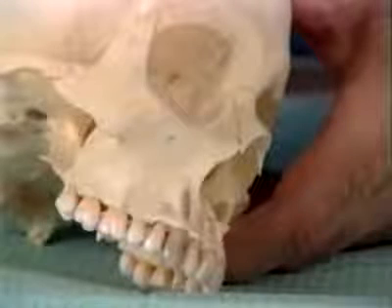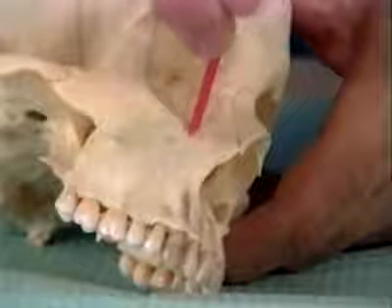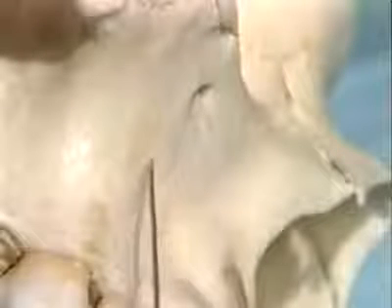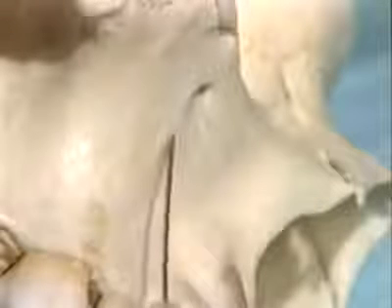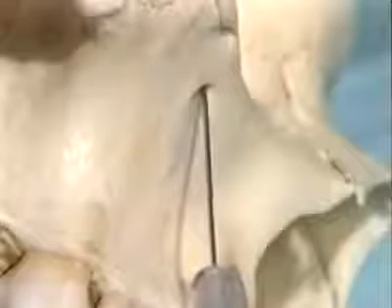An important advantage of this vertical approach is that the overhang of the infraorbital rim protects the eye from accidental needle puncture. Distal orientation of the needle bevel during insertion offers two potential advantages. First, if bone is contacted prematurely, the heel of the needle bevel will tend to glance gently off the bone without scraping the periosteum. Second, the spread of anesthetic into the foramen and canal may be aided.